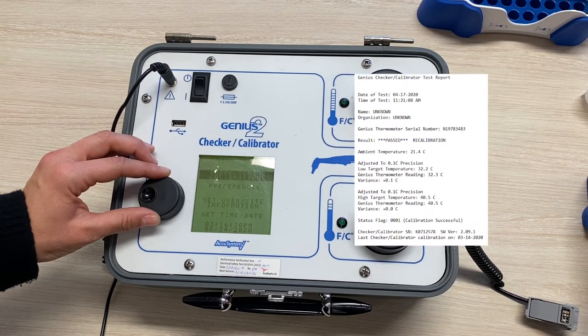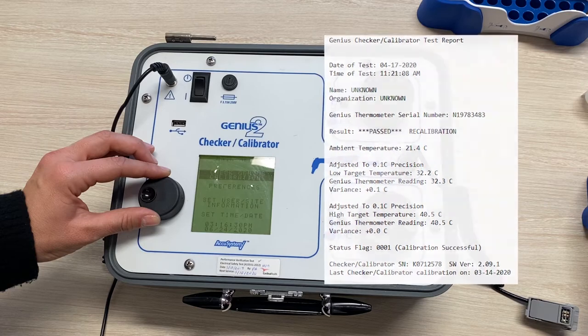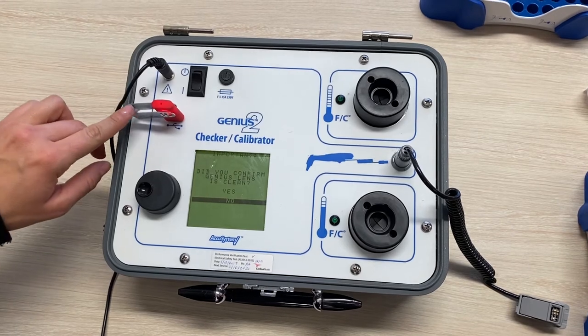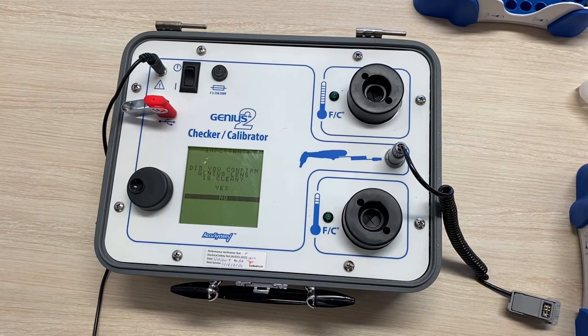If you would like, you can produce a calibration report — it's quite a thorough report. Simply add a USB to the calibrator. A USB with an LED light will let you know that it's connected successfully as it will start flashing.